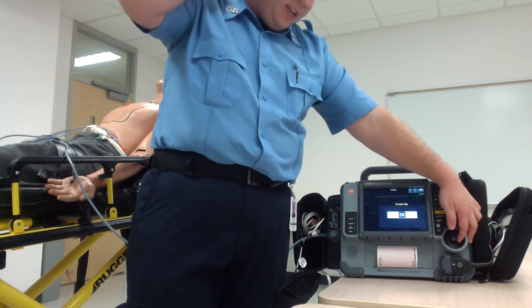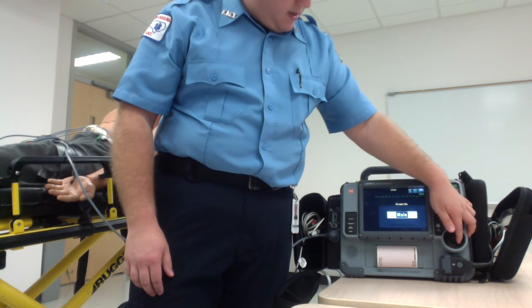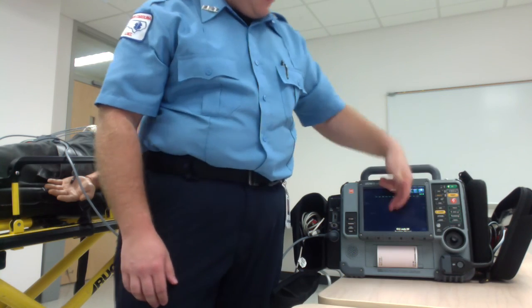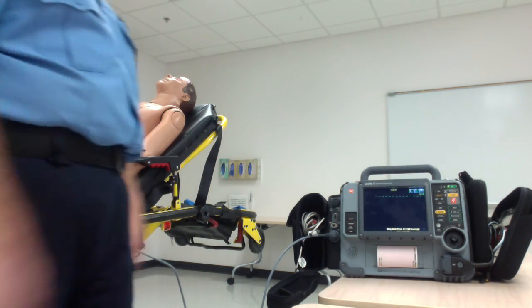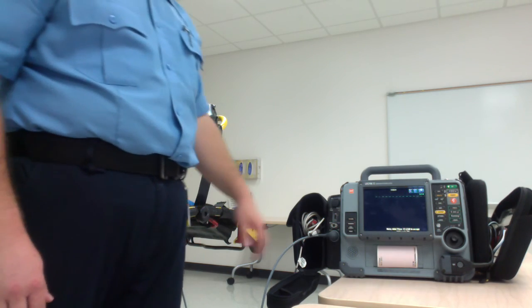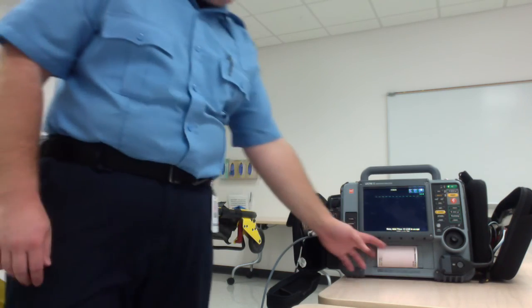Say, for example, I'm treating a 67-year-old female. 67. Select female. As I do that, it will automatically switch to acquiring the 12 lead. Since this is not a real patient, I can't get an accurate 12 lead because it has nothing to read. But again, very simple. It will then print off a reading.